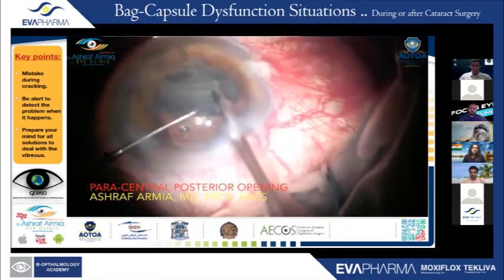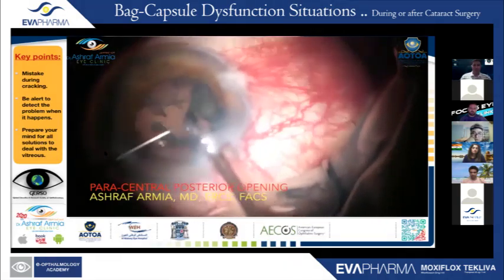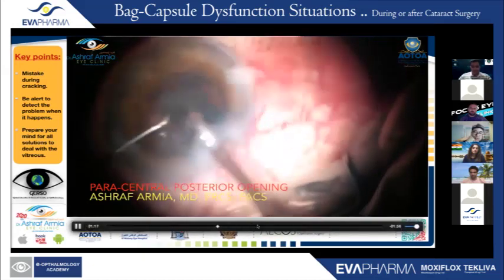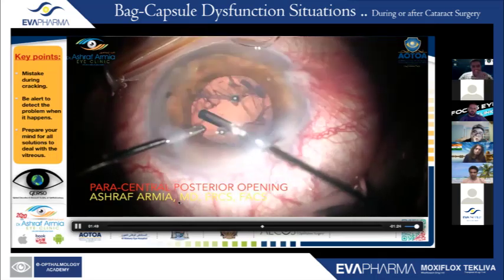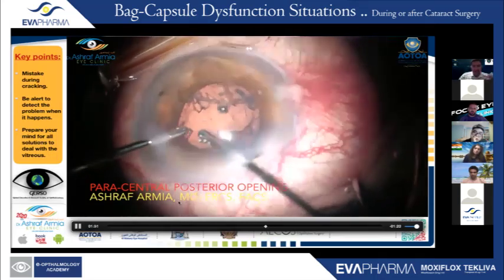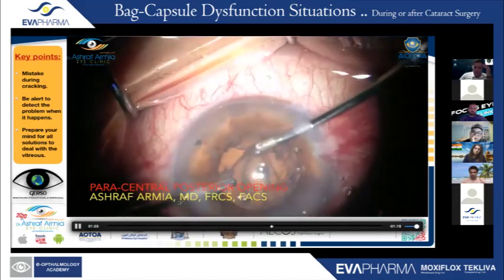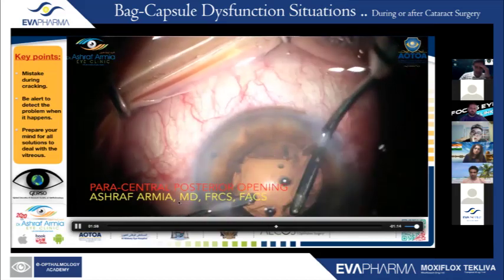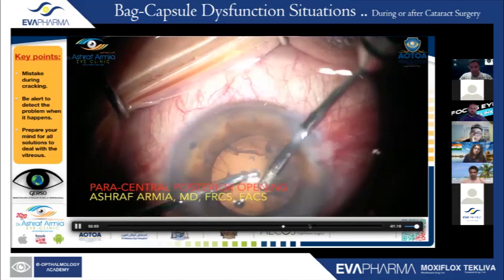So I slowed everything. I put a viscodispersive, very important, not to disturb the vitreous, but still there is a vitreous band. So the aim is to do the vitrectomy. In this case, I go inside the hole to the vitreous and take some vitreous. See, you cannot see the opening now because I removed a lot of vitreous bands, but still there is some vitreous band.